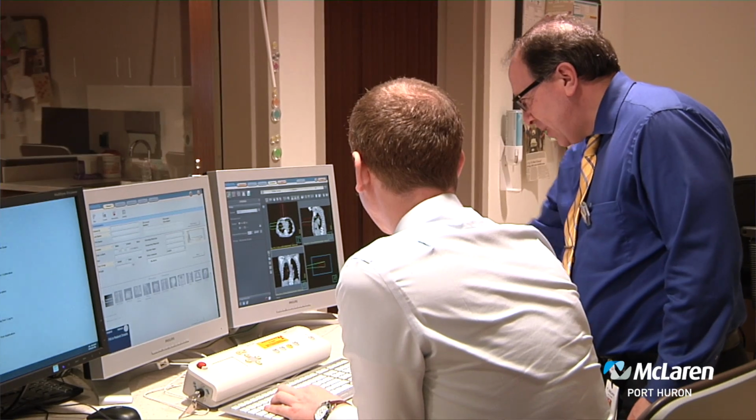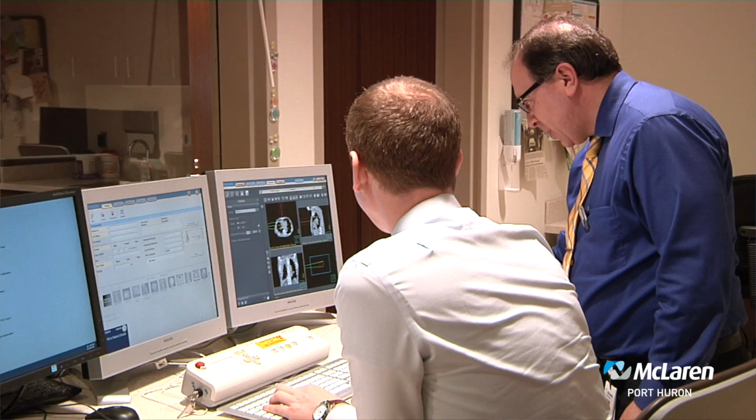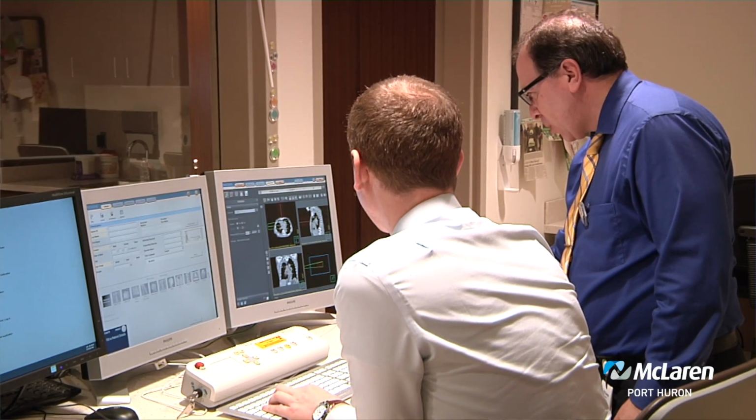Do you work directly with the patient in this plan, or how often do you interact with the patients receiving it? The only time I truly interact with the patient is on the first day when they come in for their initial CT simulation. I'll be in the CT room with the sim therapist. I will assist the sim therapist in positioning the patient for their treatments, or any immobilization devices that may be needed. And then that's pretty much my interaction with the patient on the first day.